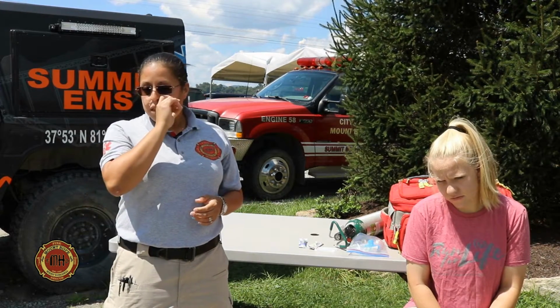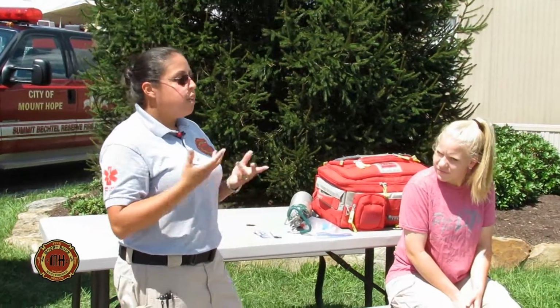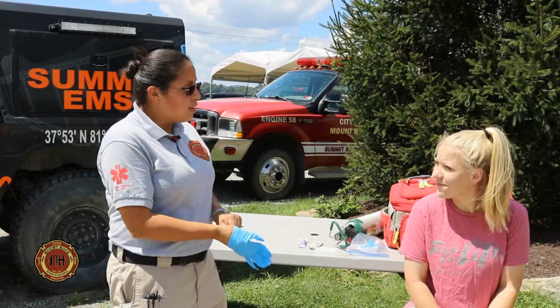So the first thing that you want to do when you have a patient is you want to make sure that you're going to have your BSI, so we're going to put on our gloves. We want to make sure that we introduce ourselves to our patient.